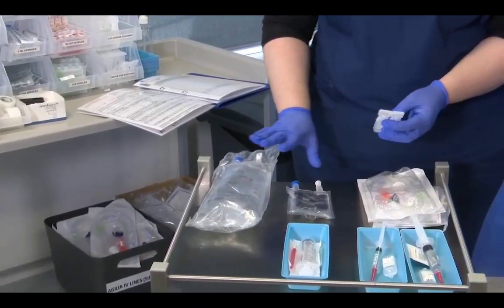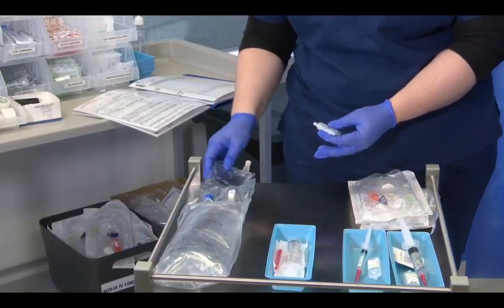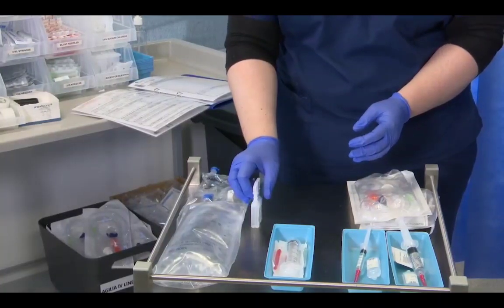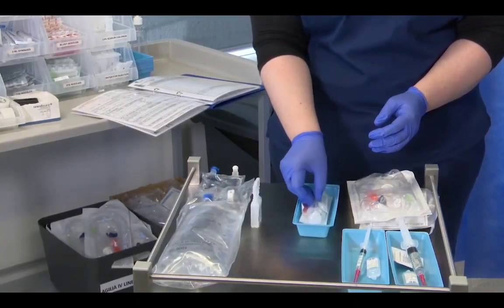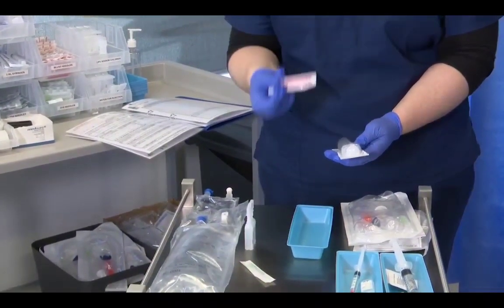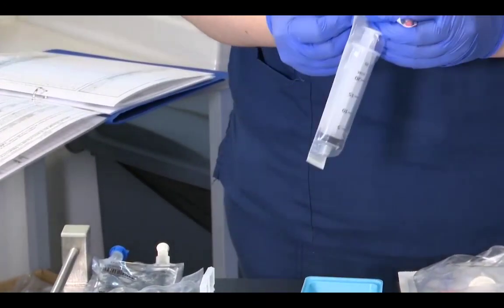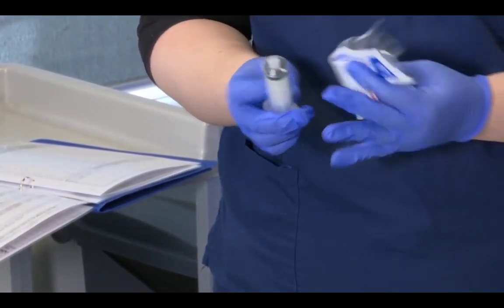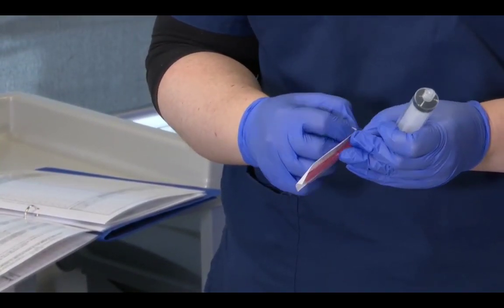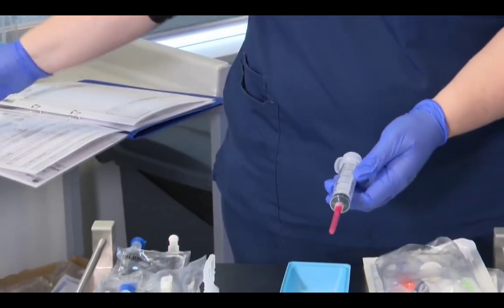I'm going to create some space on my tray, so I'm going to move my fluid out of the way and have my bag sitting just there, so there's no risk that anything can touch the bottom of it. I'm going to grab my blue tray. My green needle I'll need in a minute to inject into the bag, but at the moment I need the red needle. I have my 20 ml Luer-Lok syringe, which I'm going to open. And I'm going to open my red needle and Luer-Lok that onto my syringe.